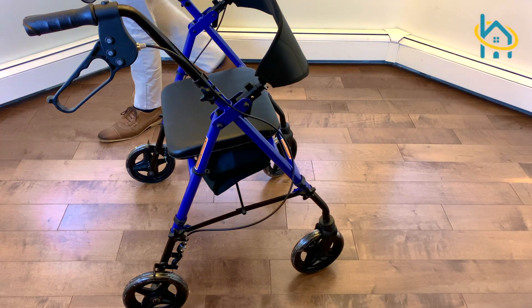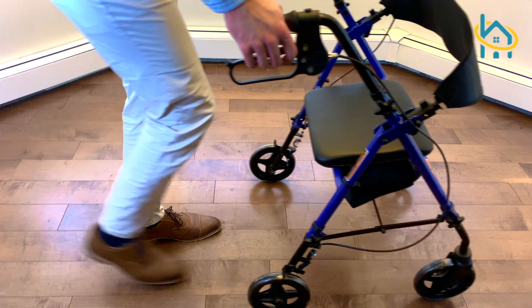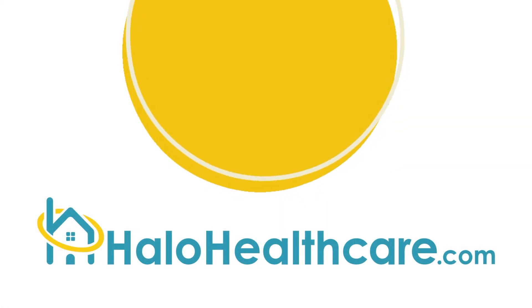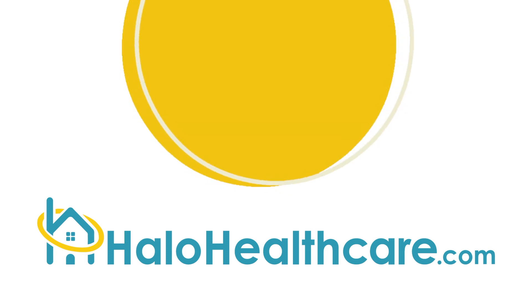If you are suffering from back pain, arthritis, muscle weakness, deteriorating balance, or any other related afflictions, the MOB aluminum folding rollator might be just what you need. Visit halohealthcare.com today for all of your mobility and home healthcare needs.